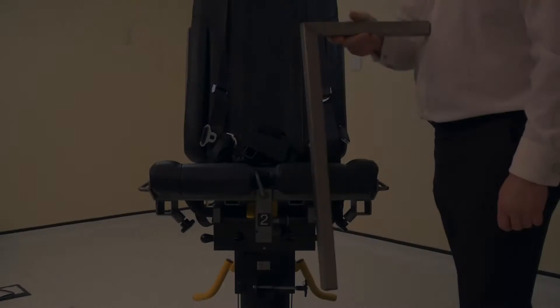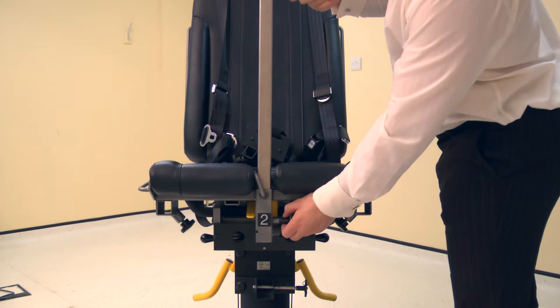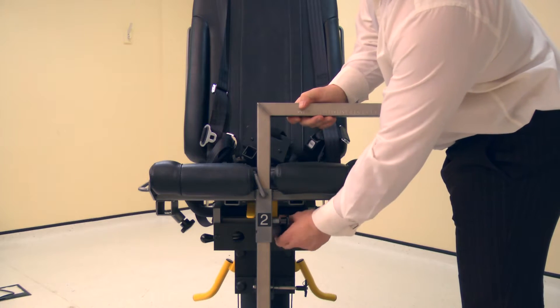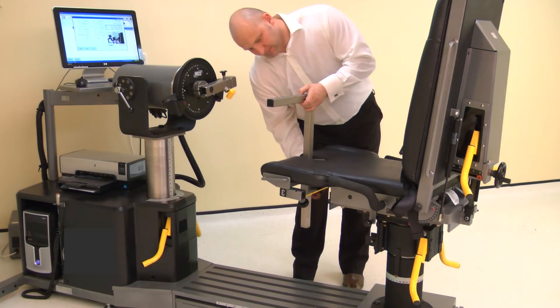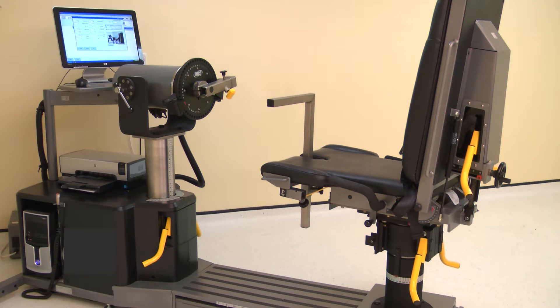Now attach the thigh forearm stabilizer tube into tube number 2 on the chair. Ensure the tube faces towards the side to be tested. Pull the locking pin and slide into place, then secure with a screw. Top tip: leave the stabilizer high enough to slide the leg underneath.